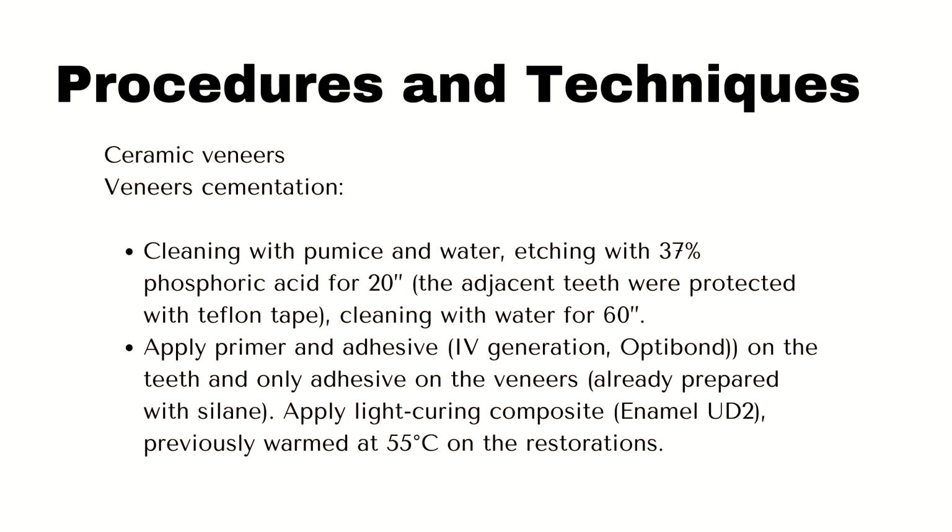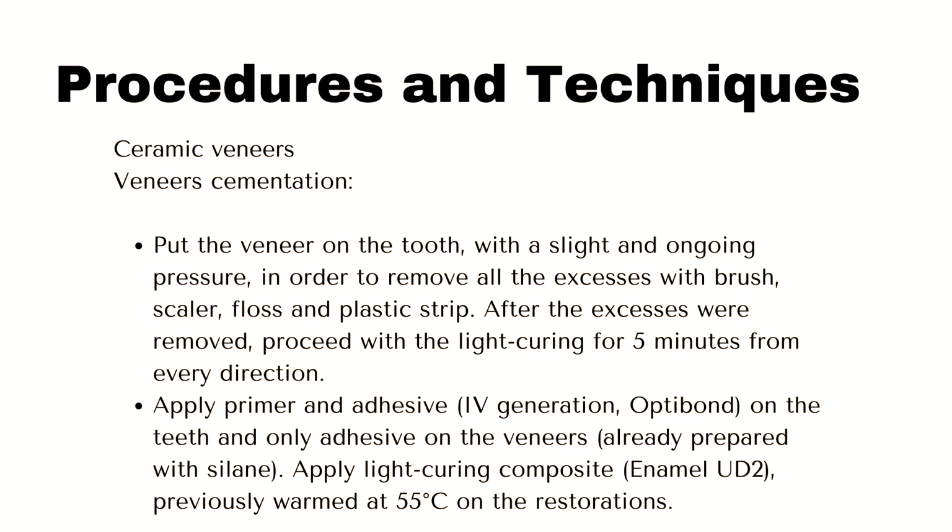Primer was applied, and adhesive, especially the fourth generation, the Optibond, on the teeth, and only adhesive on the veneers already prepared with silane. Apply the light curing composite, previously warmed at 55 degrees Celsius, on the restoration. The veneer must be put on the tooth with a slight ongoing pressure in order to remove all the excesses with brush, scaler, floss, and plastic strip. After the excesses are removed, proceed with the light curing for 5 minutes from every direction.